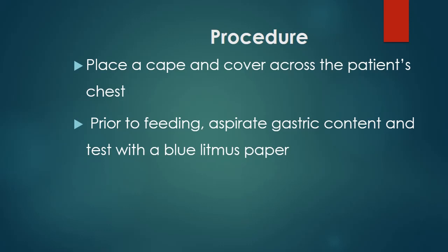However, by virtue of the setting we find ourselves, excuse me to say, it's almost impossible to confirm using the imaging studies because the facilities are not there. That is why we mostly rely on the testing with the litmus paper. But in the wards, where even the litmus paper is a problem to come by, you may see people putting a bowl of water and dipping the end of the NG tube inside that bowl, such that when you see bubbling of water when the tube is inserted into the water, then it is suggestive that the tube is not in the gastrointestinal tract, but it is rather in the respiratory tract.